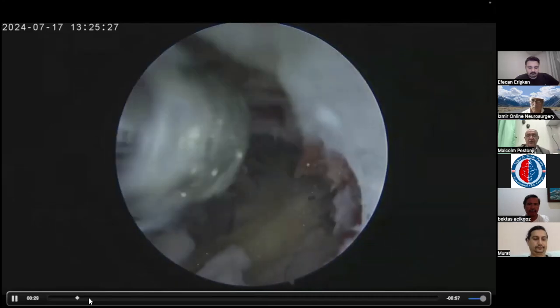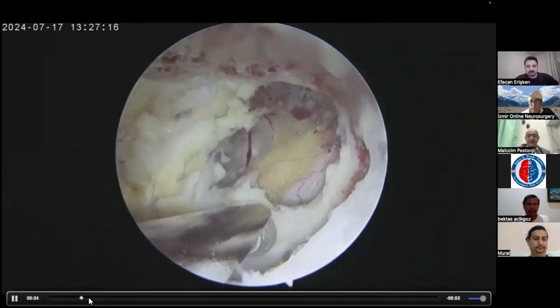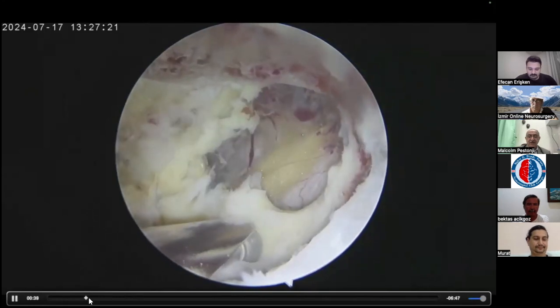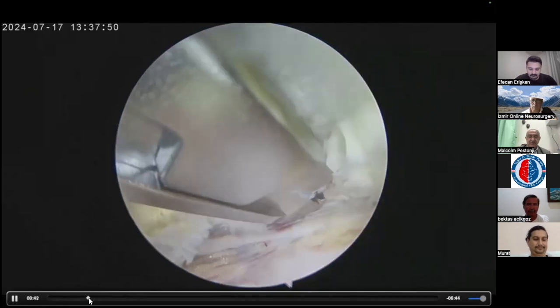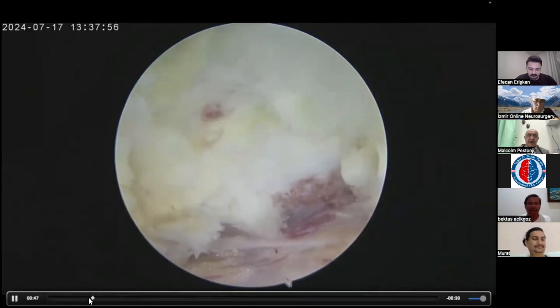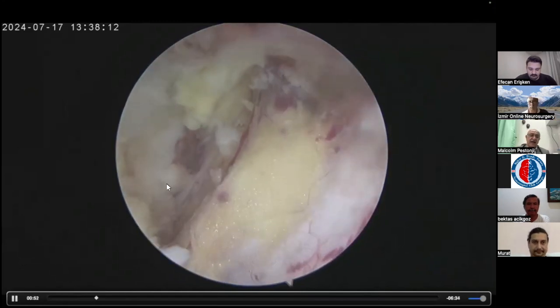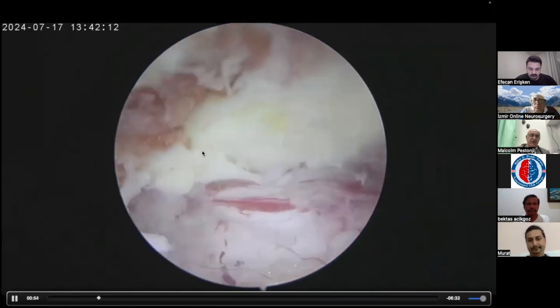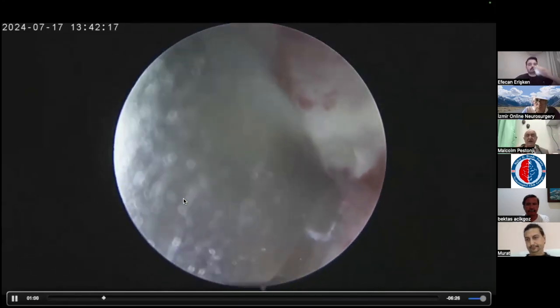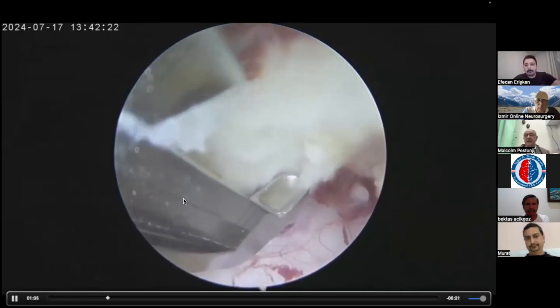I'm doing a little more burring on an open dura. I'm going underneath. I'm cutting on the IAP SAP shelf, exposing, yes, that is the SAP. And now I've switched over and I've come underneath. I've done ipsilateral. So this is the opposite side, opposite lateral recess. I've gone into the opposite lateral recess. And now I've come on my own side, and I'm undercutting this ipsilateral side.